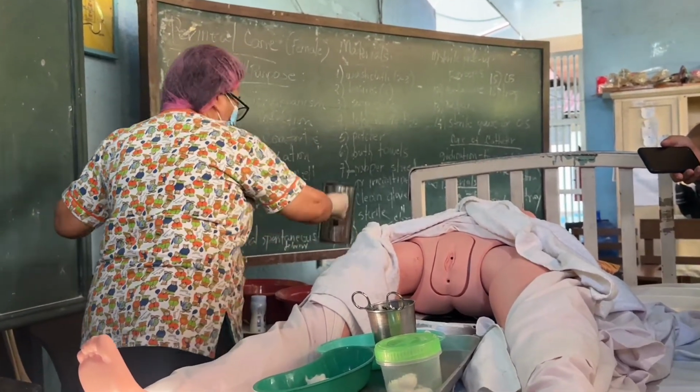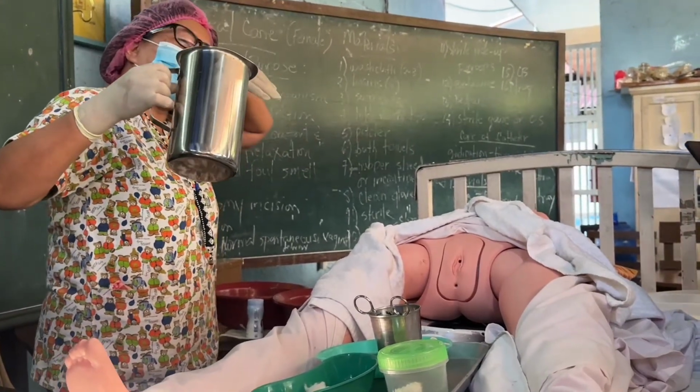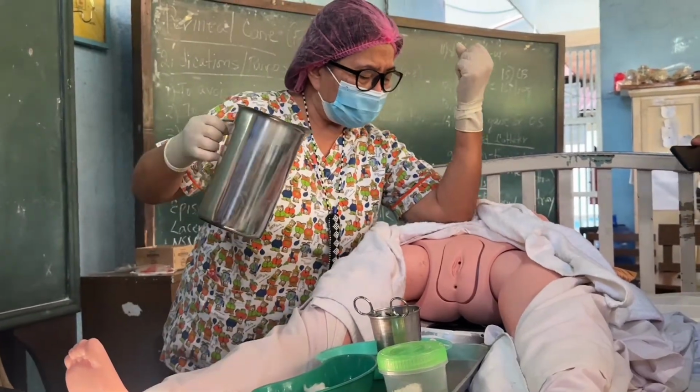Okay, so I'm going to hold the pitcher. This one. Okay, ayaw hold. Then I'm going now to rinse.